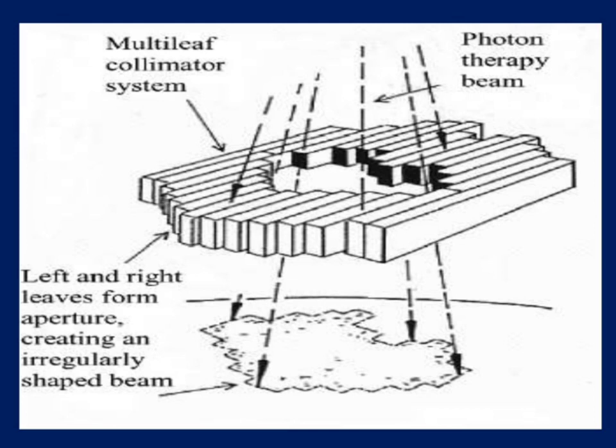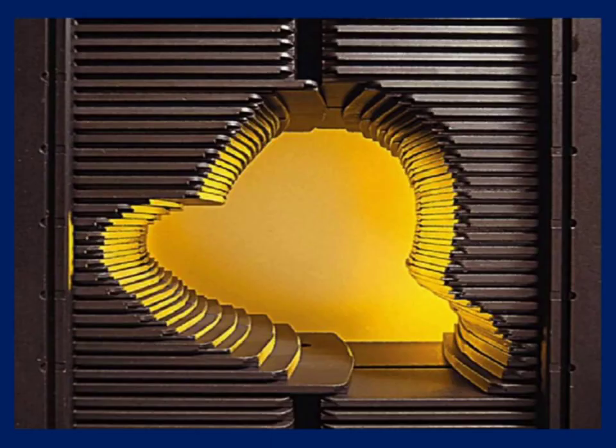Now, keeping these things in mind, I'll take you to the external beam radiotherapy treatment process, purely the 2D radiotherapy planning. What is 2D radiotherapy planning? Only two dimensions are covered: the first dimension is height and the second is width. But what about the third dimension, the depth of the tumor, which is not covered in typical 2D radiotherapy planning. Bony landmarks are crudely used here, seen with X-ray fluoroscopy, and the fields are designed as squares.